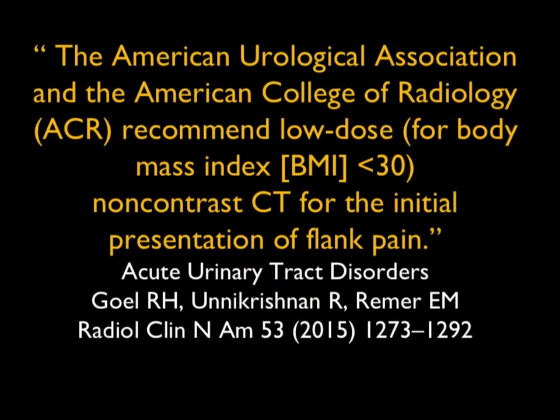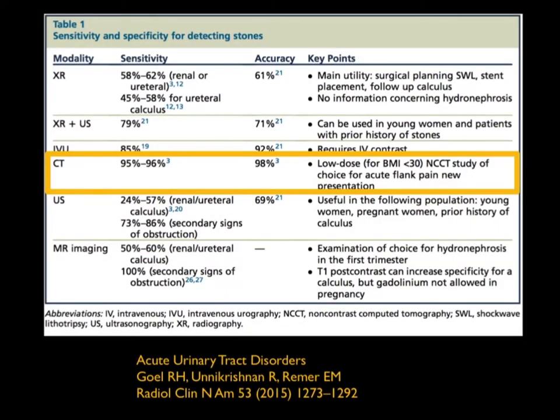So when you think about stone disease, and let's talk about stones for a little bit, CT is the study of choice. Again, non-contrast CT. And when you look at these different sensitivity and specificity for detecting stones, CT is number one with about a 98% accuracy.